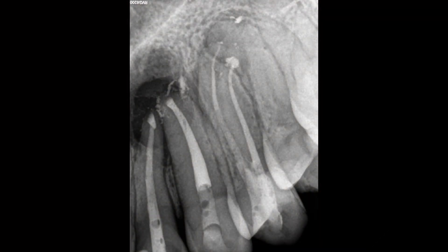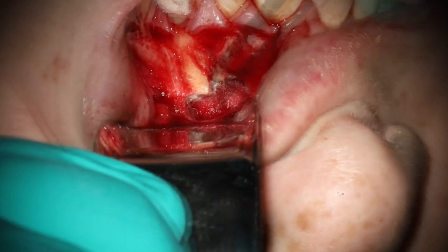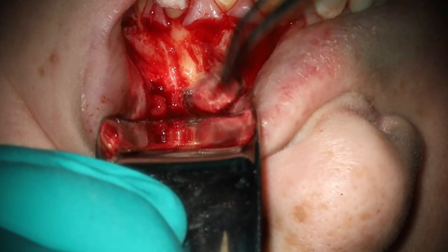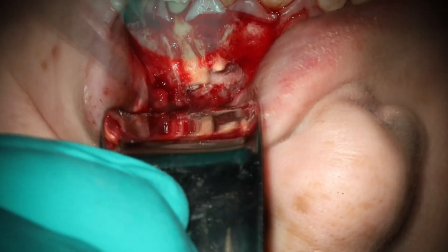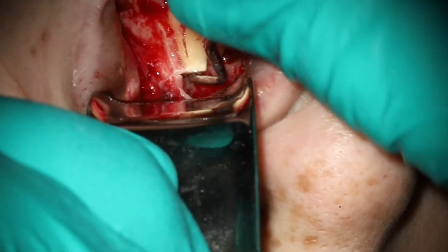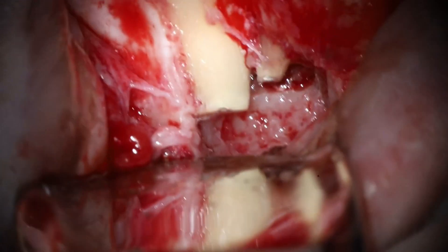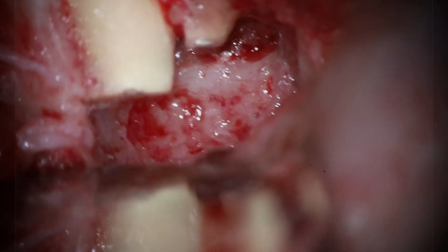Here we go for the x-ray. There is a little bit around the outside of the tooth that I do need to get off. Let's go ahead and pull those bad boys out. If you're counting, we're at three, four, and five. This is the most Brasseler pellets I've ever put inside a crypt, just because it was so large here. I like to use a scaler — this is just an R3-4 — you can throw that in your kit. It works really well to get that excess BC material.